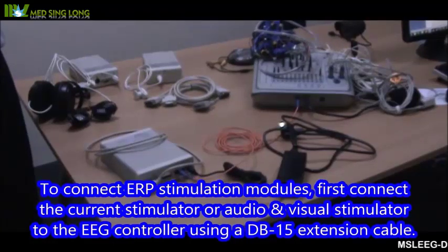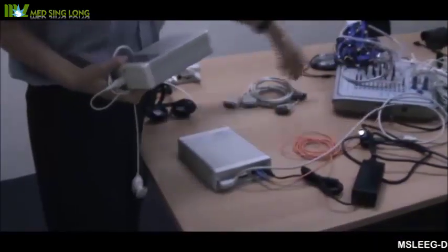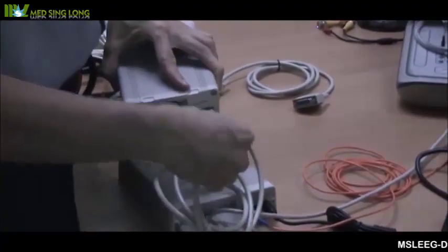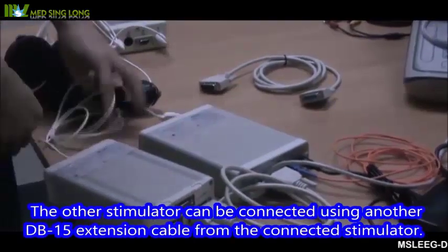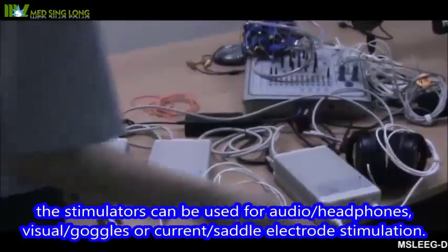To connect ERP stimulation modules, first connect the current stimulator or audio and visual stimulator to the EEG controller using a DB15 extension cable. The other stimulator can be connected using another DB15 extension cable from the connected stimulator. The stimulators can be used for audio/headphones, visual/goggles or current/saddle electrode stimulation.